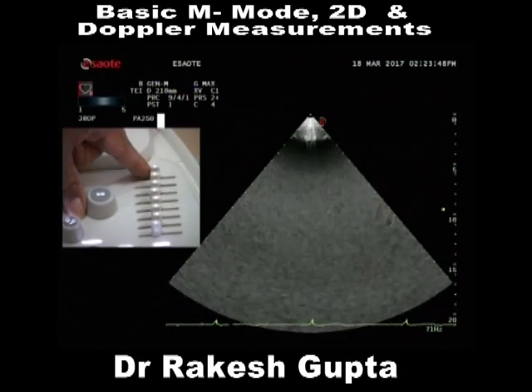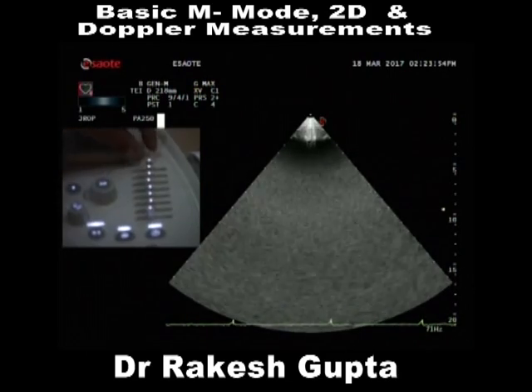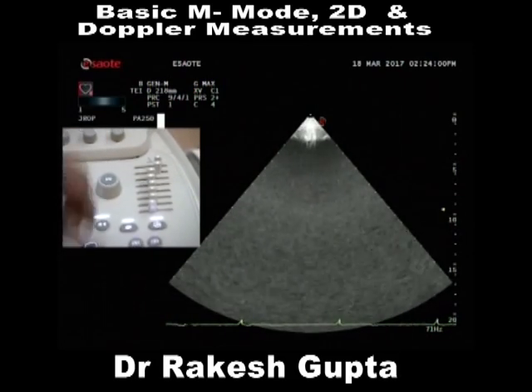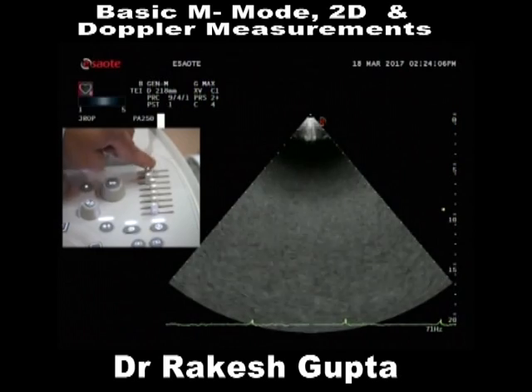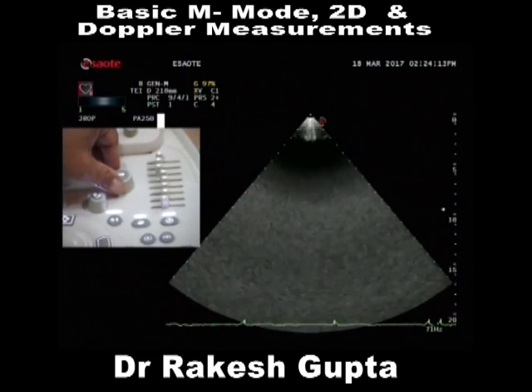These are known as TGCs, time gain compensation. Now I want to increase the gains over here. I am going to increase my gains. Now it's equal. Now it's less; look, I have reduced my TGCs. So TGCs means selective gains. B mode gains means generalized gains.